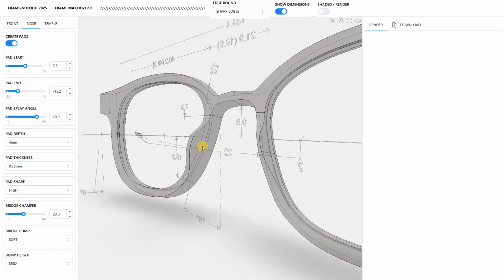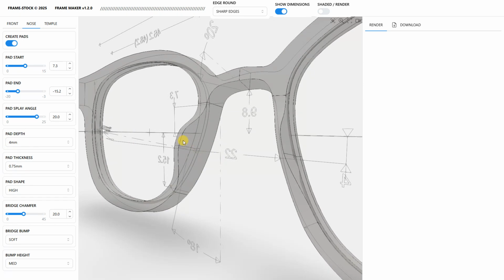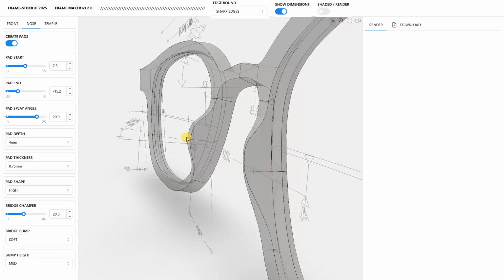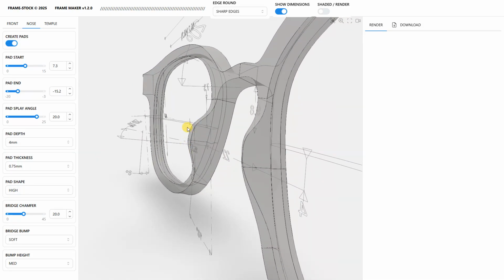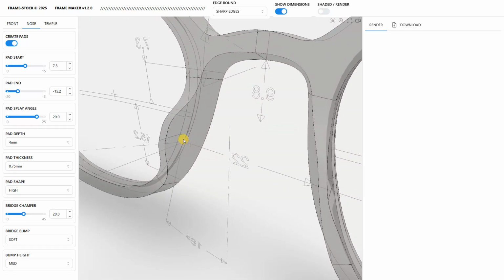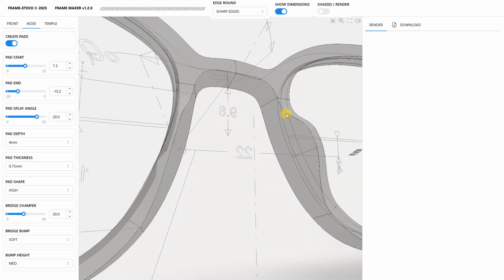Depending on that, and depending on the pad depth, so this frame's total frame thickness is 4 millimeters, and on top of that I'm adding a depth of 4 for the pad, so this is 8 millimeters approx, because it's angled, but let's say it's 8 millimeters to the tallest part of the pad, and that's going to give me this point right here, which is basically the center of the main area for that pad, depending on the pad design, of course.